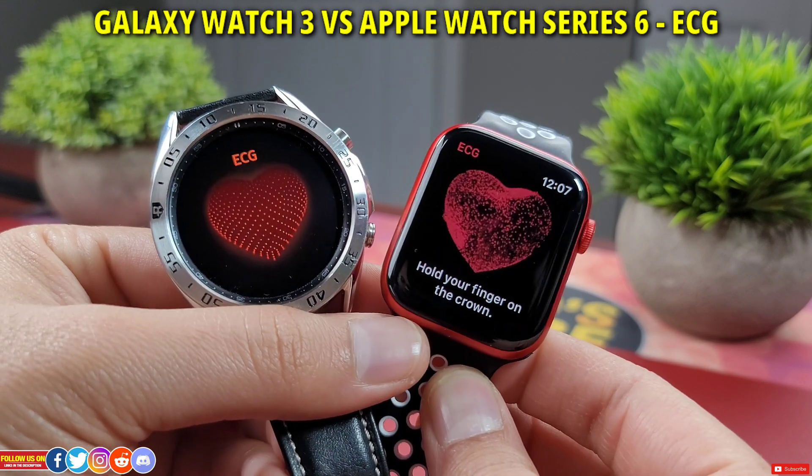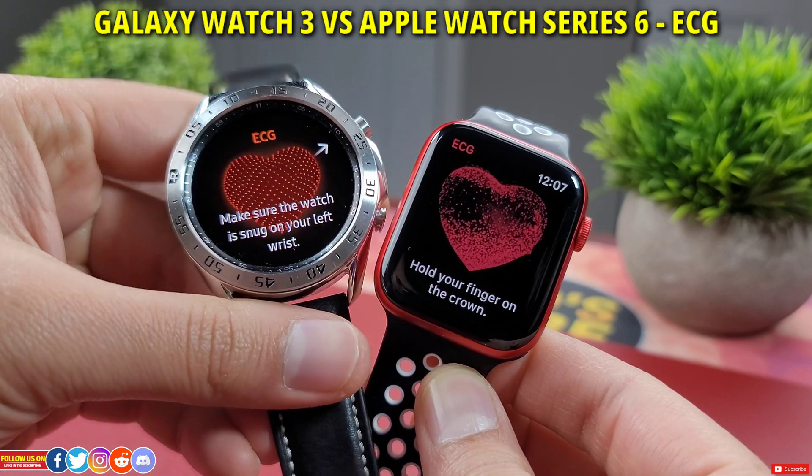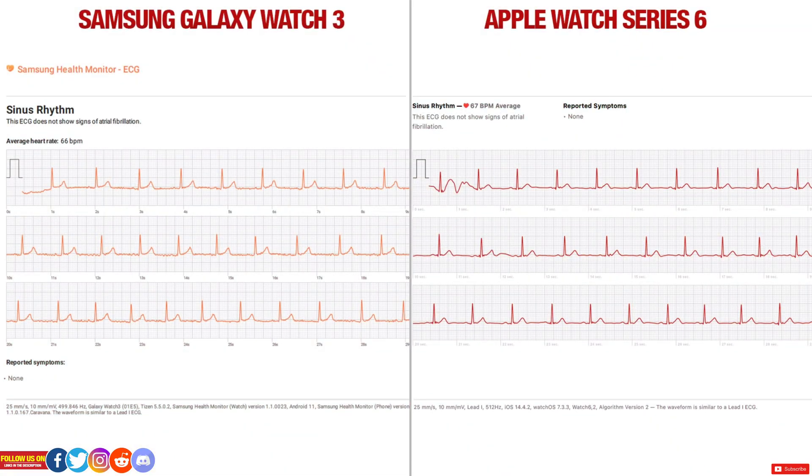Now let's compare the ECG reading from the Galaxy Watch 3 with my Apple Watch Series 6. The Apple Watch Series 6 is my personal favorite for ECG monitoring among all smartwatches reviewed on this channel. Again both graphs are normal, but I find the Apple Watch Series 6 graph is the smoothest among Fitbit and Samsung. I suppose it's because of the 512Hz sensor on the Apple Watch versus the 500Hz sensor on the Galaxy Watch 3. Both of these watches will ask you to input any symptoms at the end of the reading, which is really cool. So out of both these I will prefer the Apple Watch Series 6.